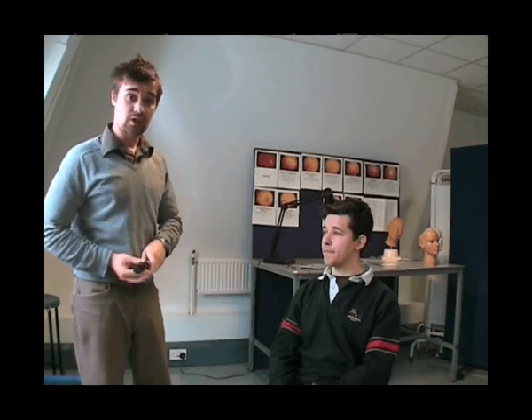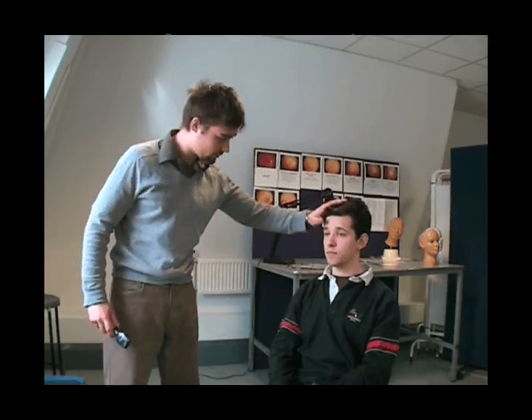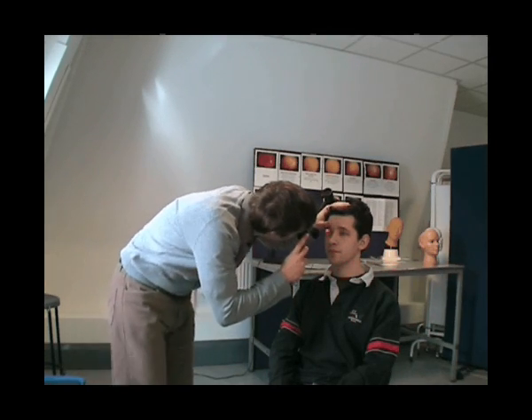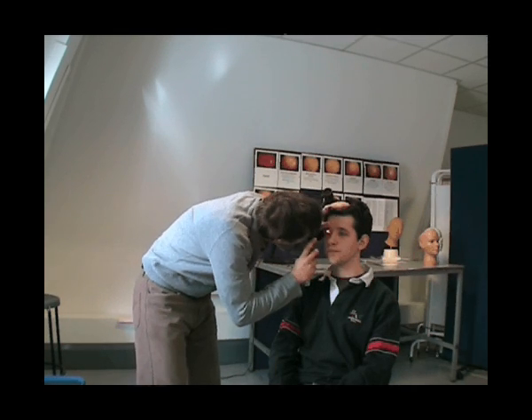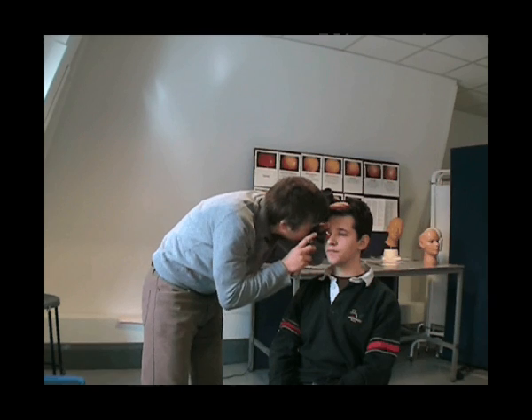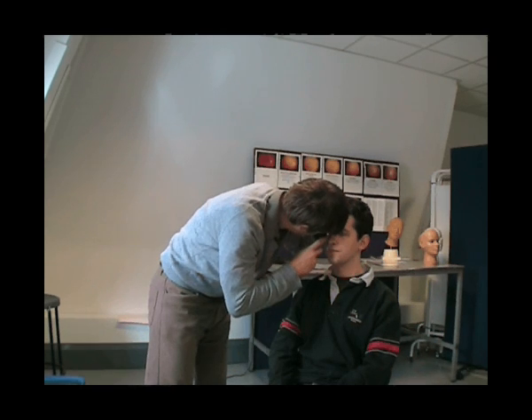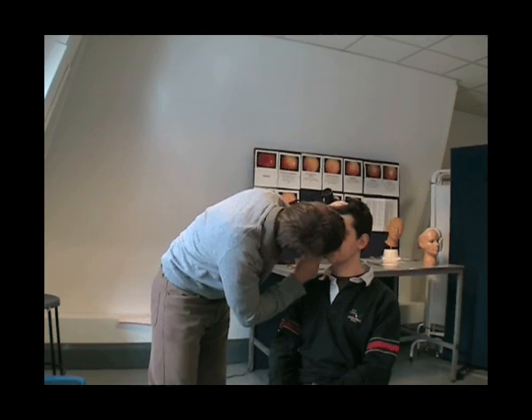Once you've found the optic disc, you would look at the vessels. You trace the vessels to the quadrants. Coming in again, looking for the red eye reflex, focusing right in. I've now focused on the retina, looking for the blood vessels, tracing them to all four quadrants of the eye: the upper nasal, the lower nasal, the lower temporal quadrant, and the upper temporal quadrant.